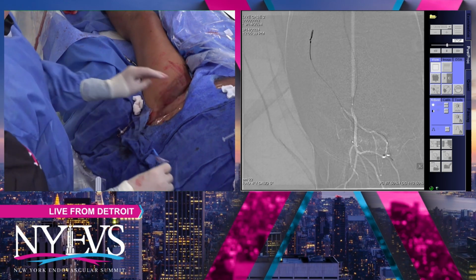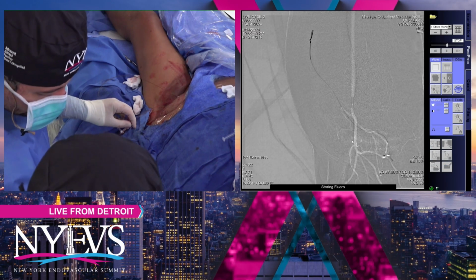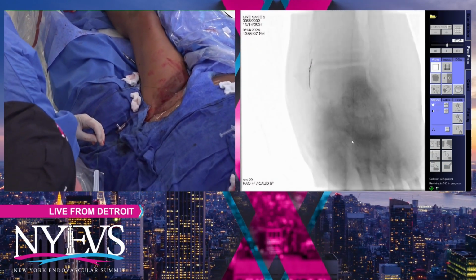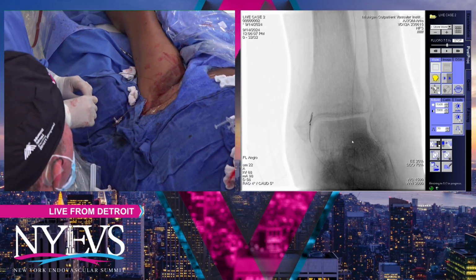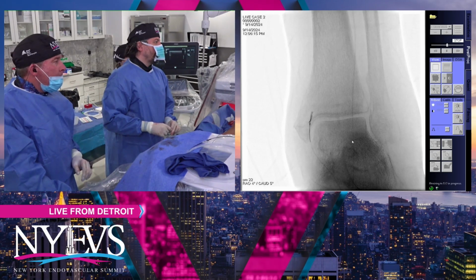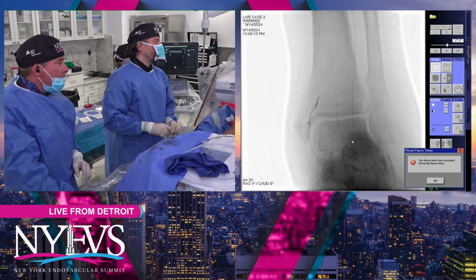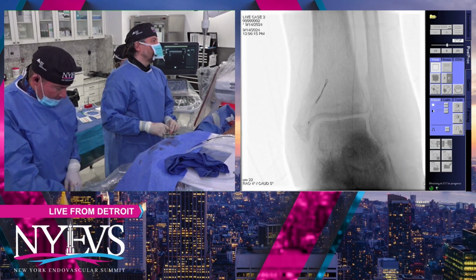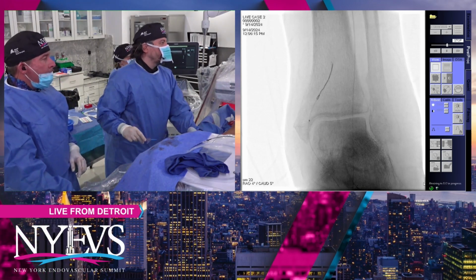And take me off-road, Matt, please. You're off. You can use a support catheter; I've moved toward using low-profile balloons because you can do hemostasis of the access site at the same time. If I'm in the right location here, I would suspect for this wire to go toward the peroneal, possibly. So we'll see. Going to advance our balloon.